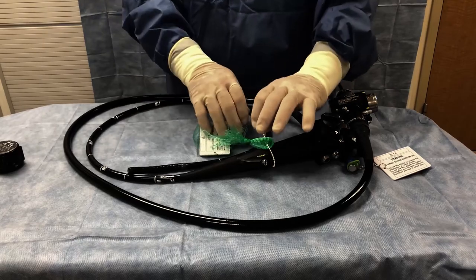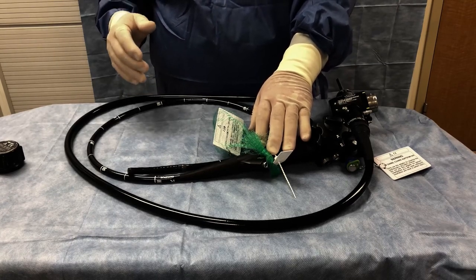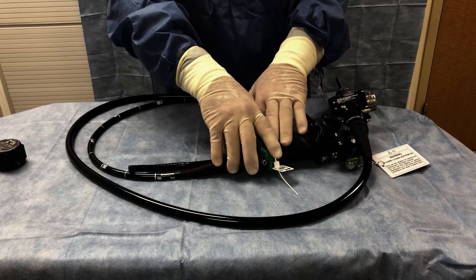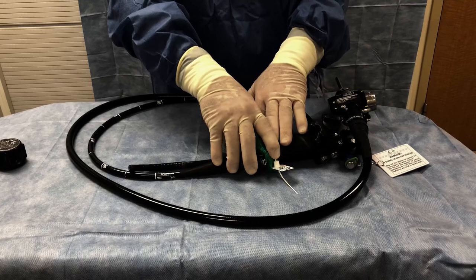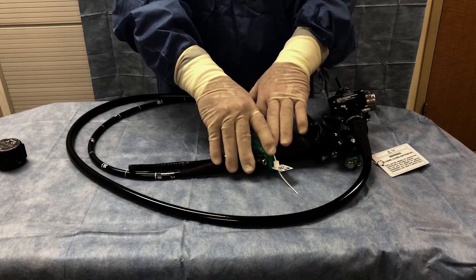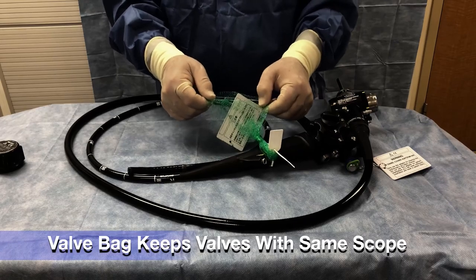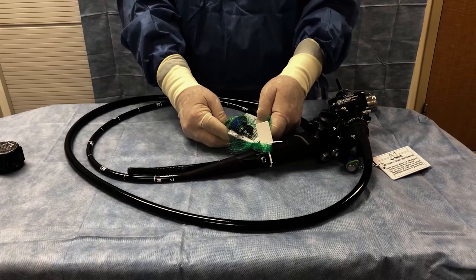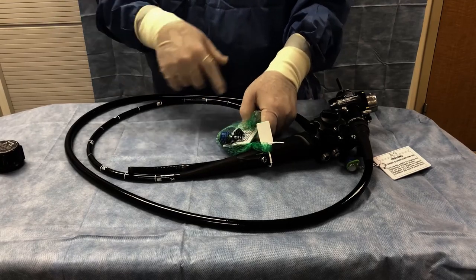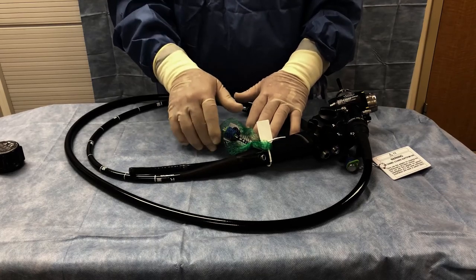Whenever the scope is processed in high-level disinfection, it has a tag attached that identifies the scope — the serial number, the machine it was processed in, and the date and time it was processed. This little green bag attached to it, which looks like an avocado bag — that is what we call them — holds the valves that belong to this scope. These valves follow the scope everywhere it goes unless one has a problem, in which case we replace it. Each scope has its own dedicated set of valves.